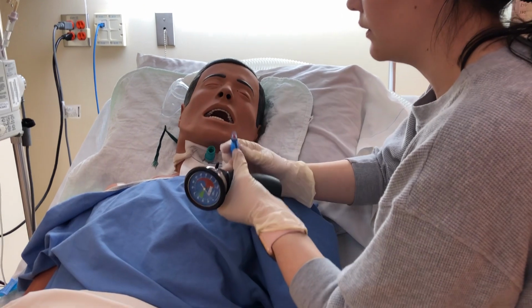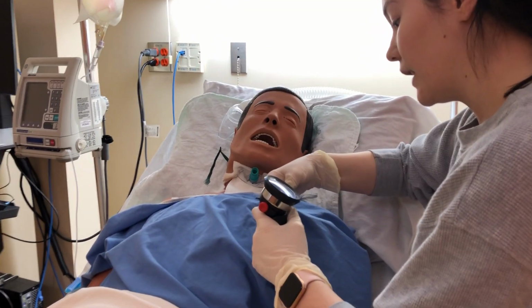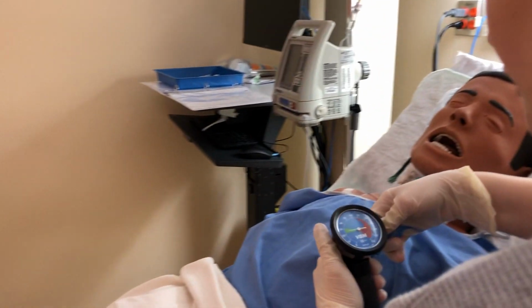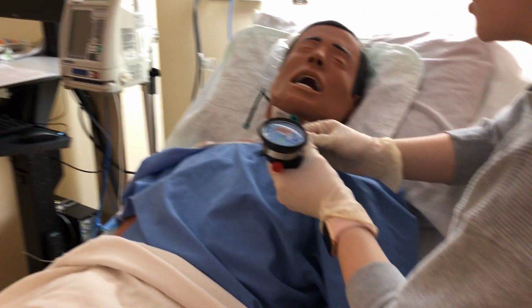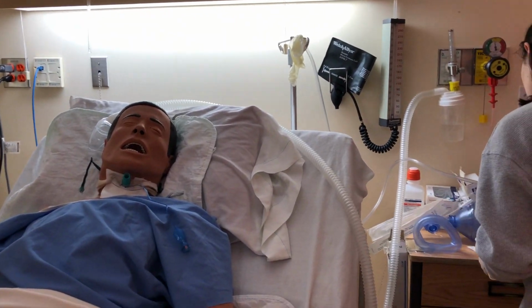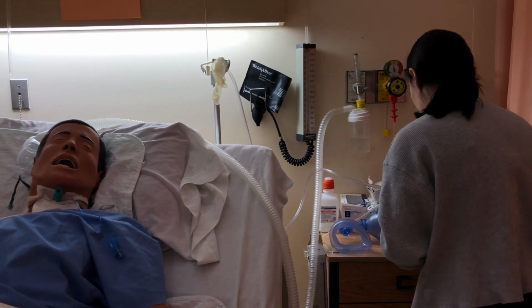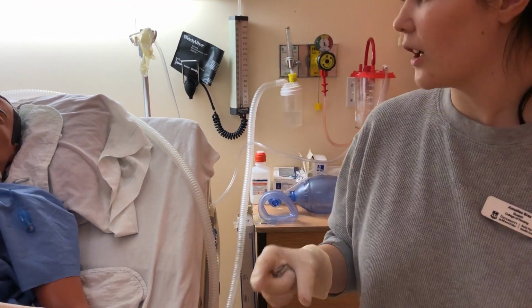Okay. Clean for 30 seconds, allowed to dry. Okay, so I'm checking cuff pressure. I'm making sure that it's in the 20 to 30 range, and it is. So the cuff pressure is good. Okay, I'm going to close that now, and I'm going to return that. So now cuff pressure is done.